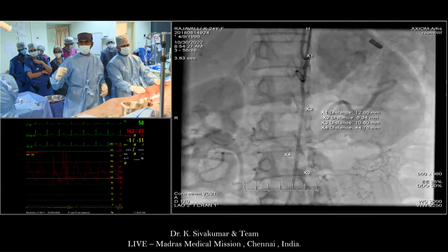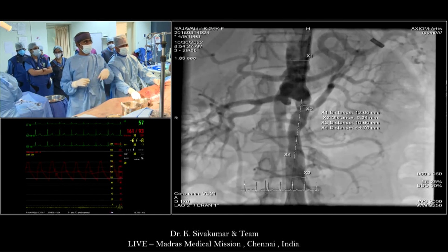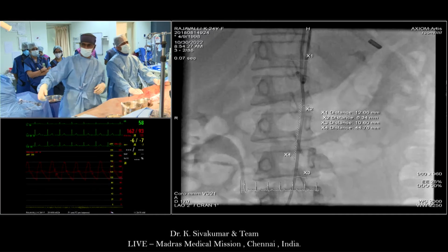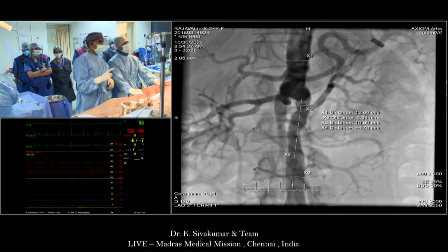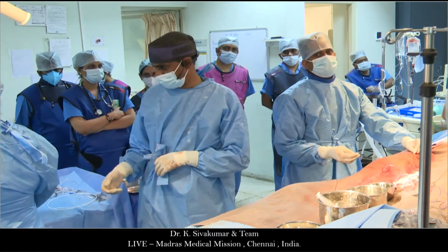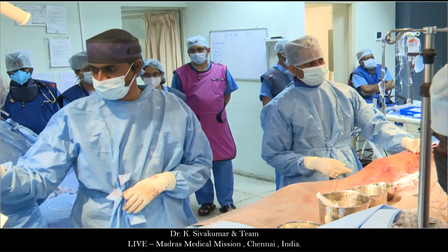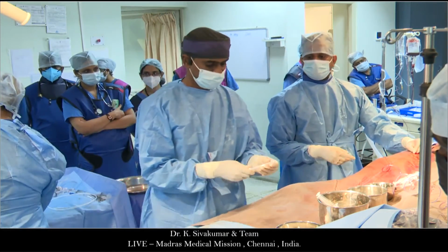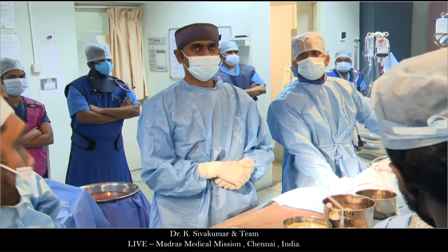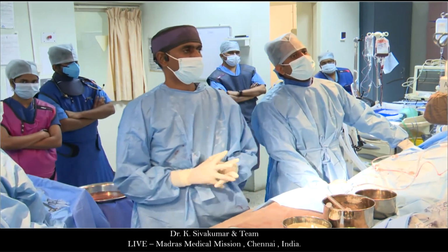Get me Shiva. Shiva, we're going to move back to Sidra now, and so you carry on in case we need you. But we'll go to Sidra next. Our plan is to stent the abdominal aorta with a bare stent. I will show you later. Thank you. Shiva, we're going to move on now. Keep going though. We may come back to you. Hey Shiva, we see you very well. Can you hear me also? Yes, I can hear you very well. This wire is too short.